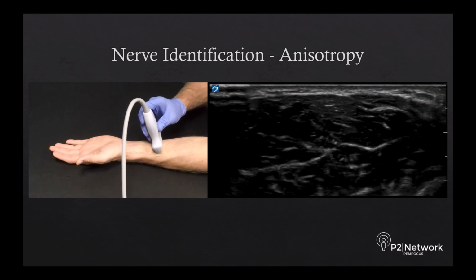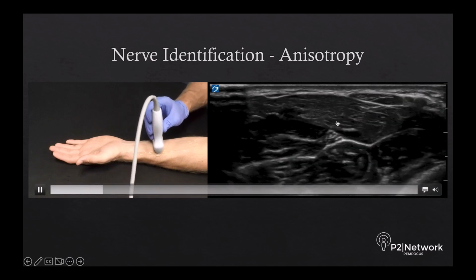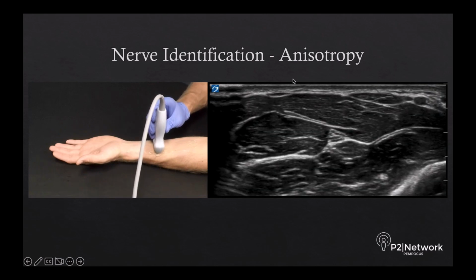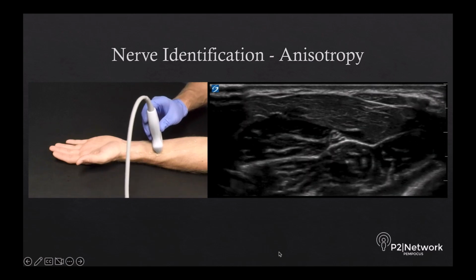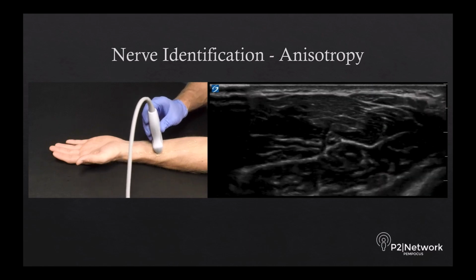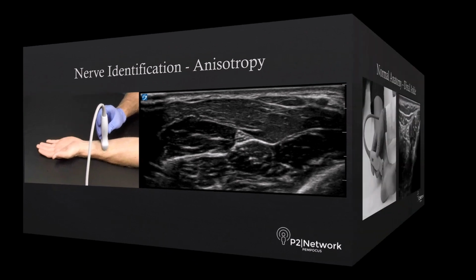and when we have a more oblique angle with the probe, we have a far inferior view of the nerve, and that's owing to the fact that when we are vertical, our sound waves are coming down, hitting the nerve and bouncing right back to it. But when our probe angle is hitting it at a more oblique angle, the waves come in, they're refracted off, and we lose a lot of signal coming back. So really, not only when you're tracking do you want to find the location of the nerve with the movement of the probe, you also want to spend time fanning to make sure you've got that optimal angle of incidence.